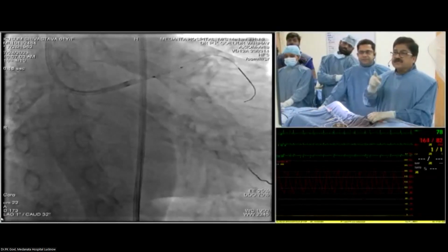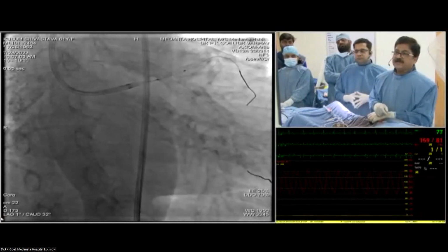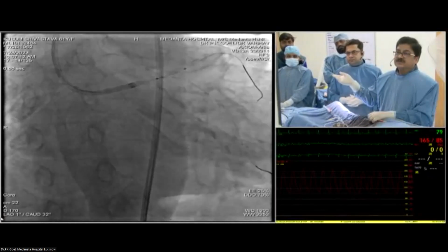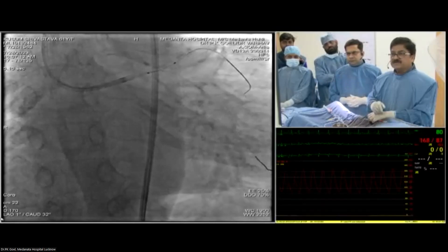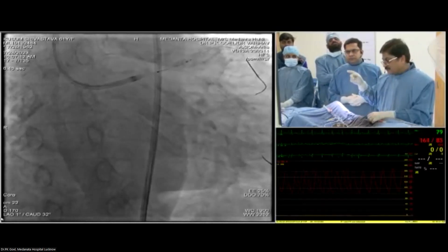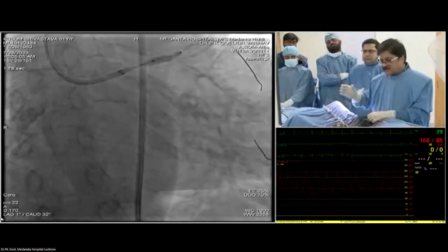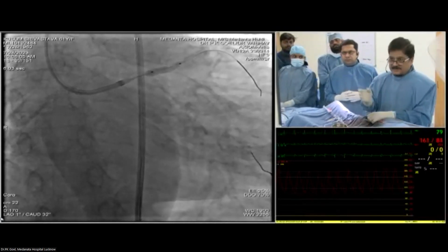So this was the IVL. This was a 4.0 IVL, and you see how it slips out. You could easily take an IVL balloon without any pre-dilatation. Yes. Okay. You see, it slips out. That tells me, when balloons slip out when you do full inflation in one go, that the lesion is not responding. And this is only at 4 atmospheres and it is slipping out.